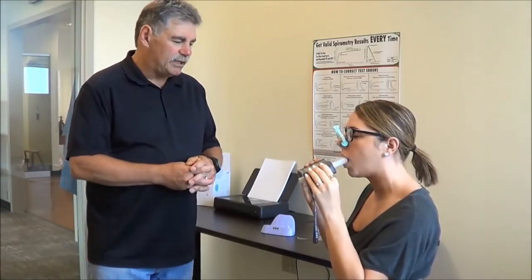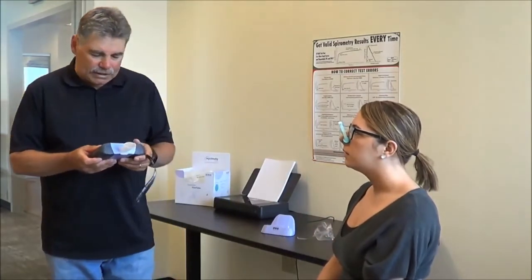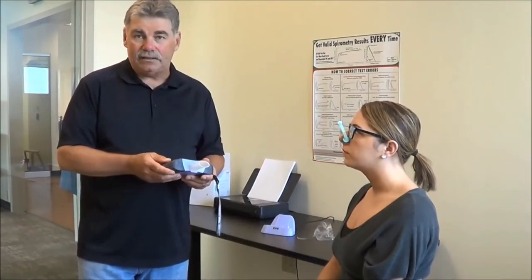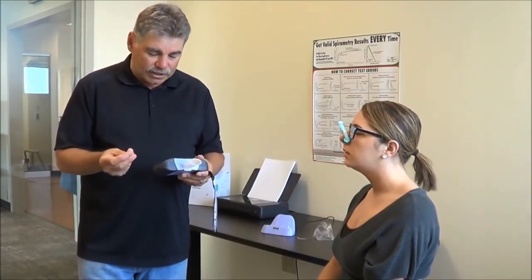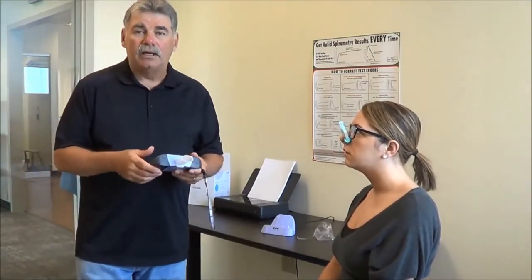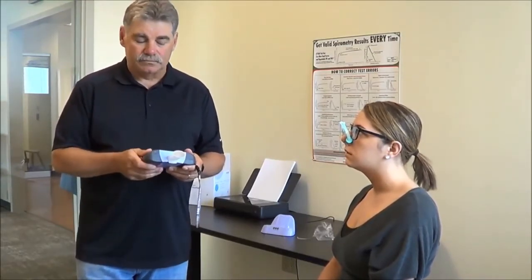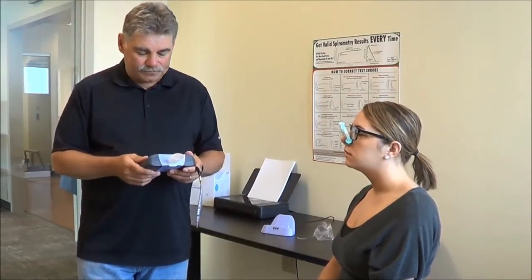Push. Nice. Good job. So, I have session complete, okay, with a grade of A, meaning that we have three acceptable trials where the reproducibility is actually better than 100 milliliters for an A, and 150 would have been a B. B would be good enough. C is good in a pinch. We really would like an A or a B.